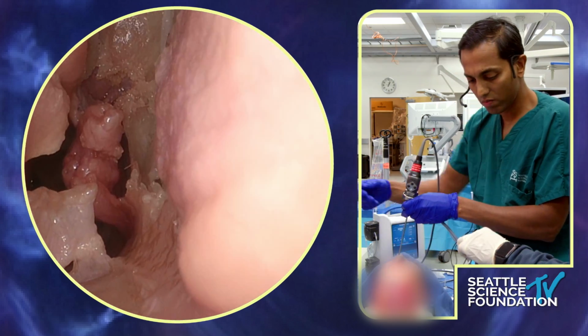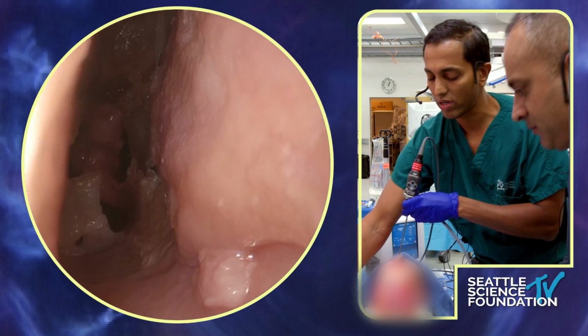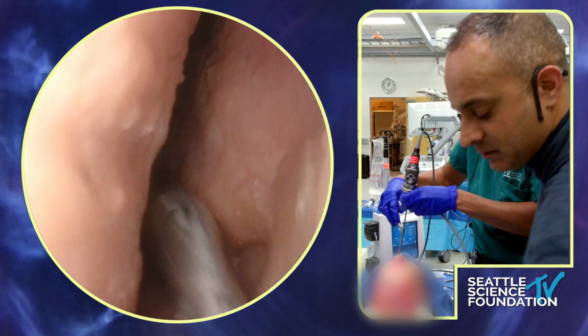Thank you. Yeah, perfect. Yeah, I'll take that. This should work. I can keep that straight. So we have it. Thanks so much. 3:30.